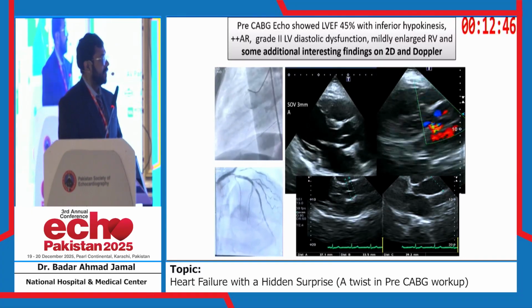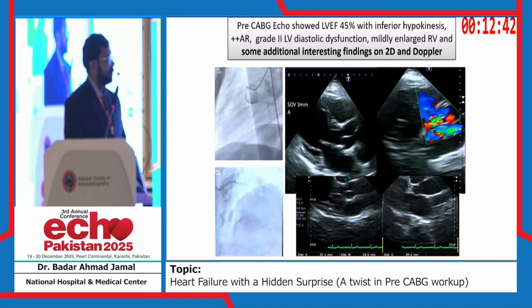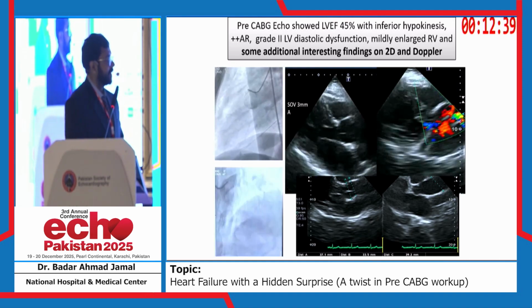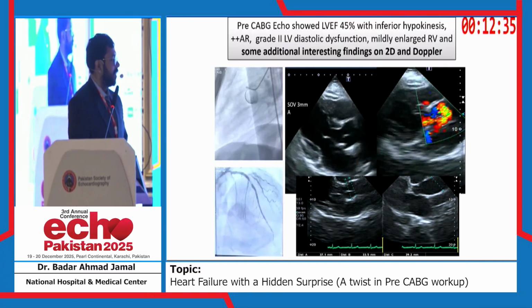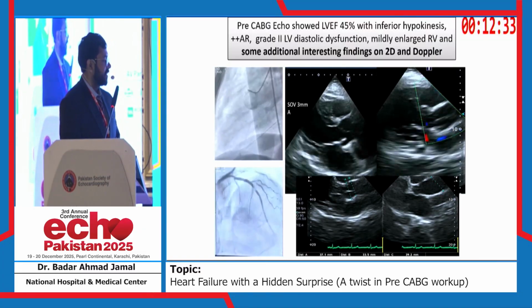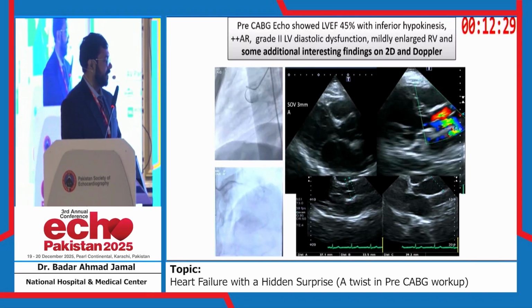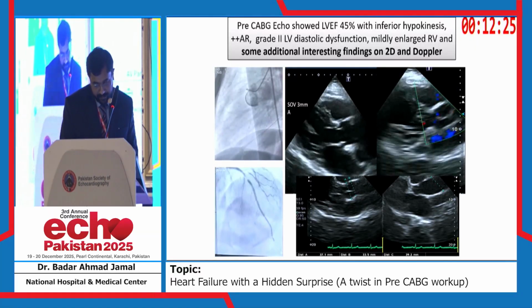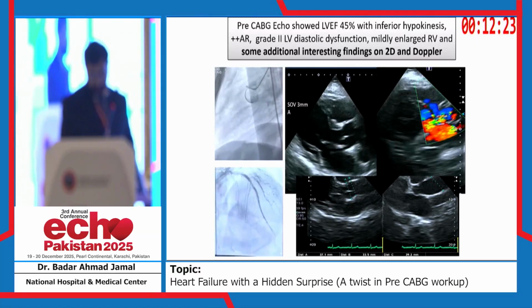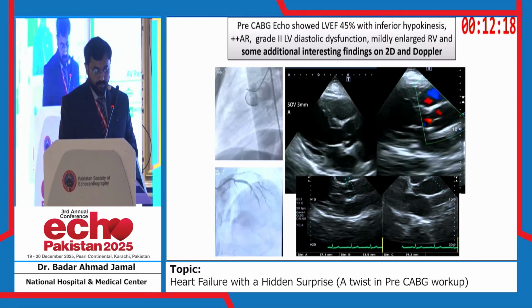On the right side, as we can see, when the aortic valve area is interrogated with color Doppler, we can see backward color flow turbulence during diastole, suggesting AR that is around mild to moderate in magnitude. Here we can see some measurements, with the aortic root measuring 33.5 millimeters, and the ascending aorta 39 millimeters, that is slightly dilated. So moving forward.